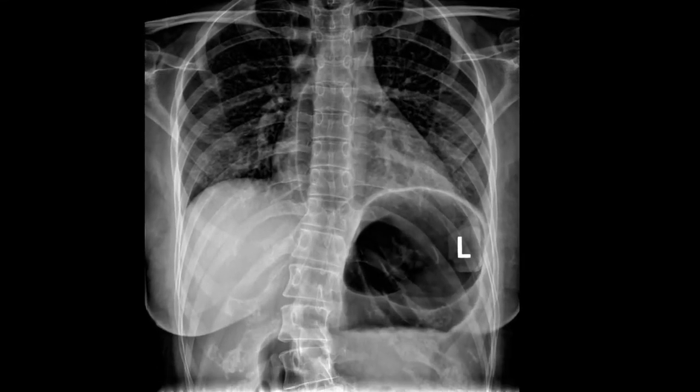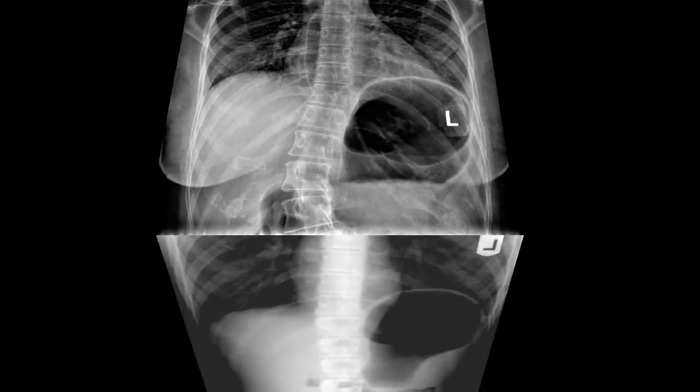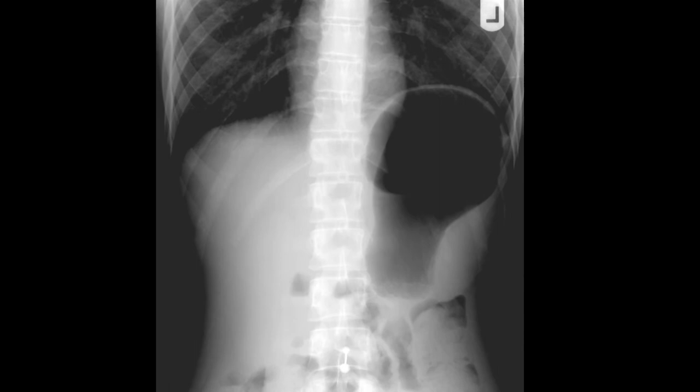On this patient there is a large amount of gastric air visualized under the left hemidiaphragm in the left upper quadrant of the abdomen. Although this is a lot of gastric air, it's normal. This is a considerable amount of gastric air and although it may look alarming, it's within normal limits — it's underneath the hemidiaphragm in the left upper quadrant. This is acceptable.